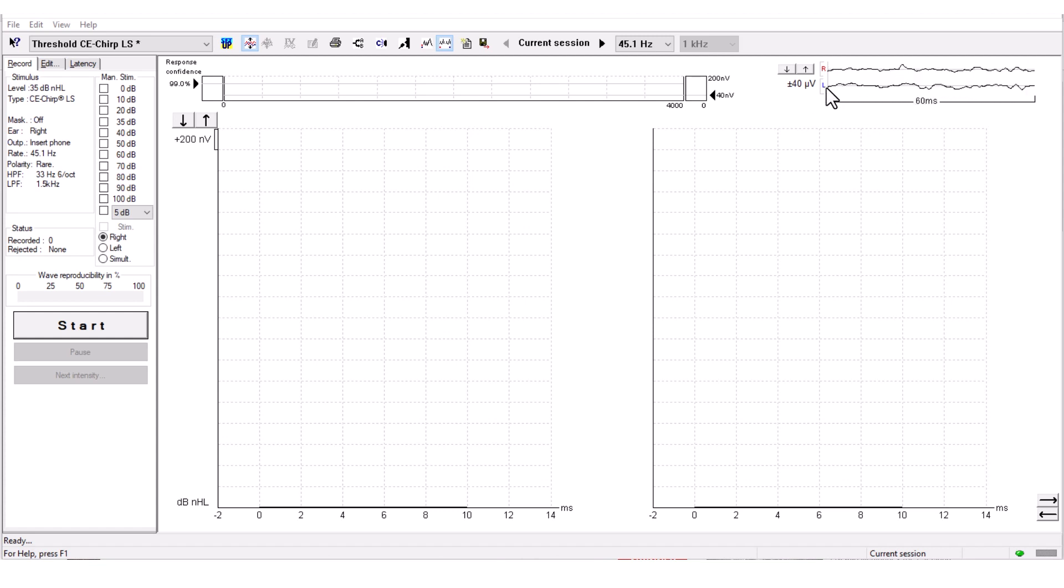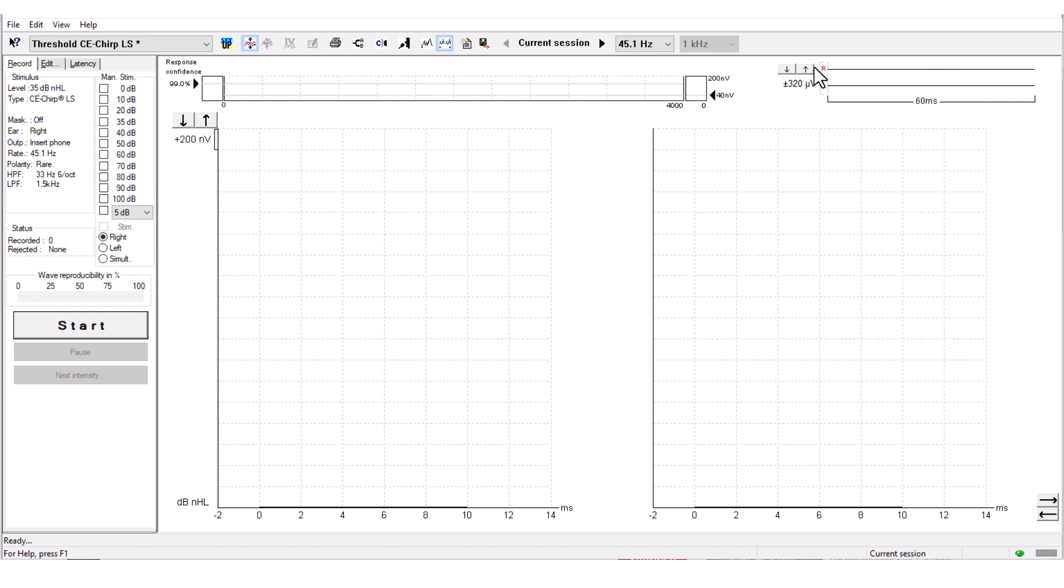You can adjust the rejection to such a degree that no sweeps will be rejected. However, the lower the EEG, the less noise introduced to the measurement.